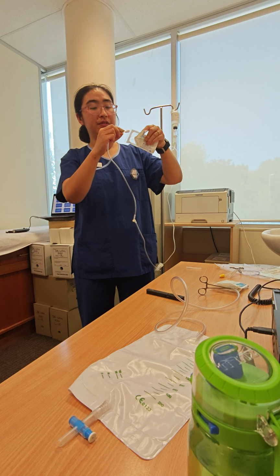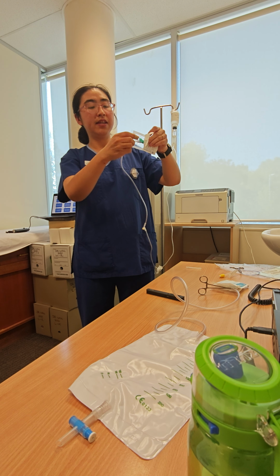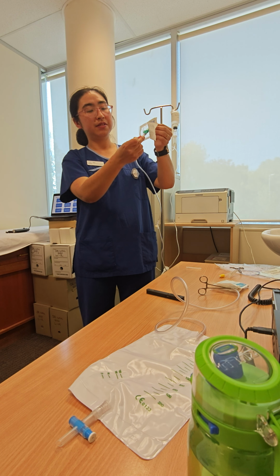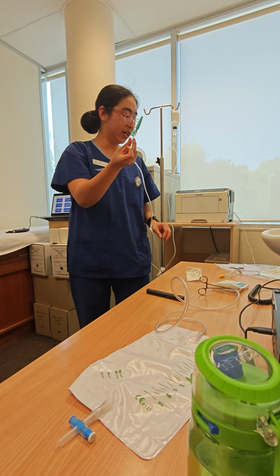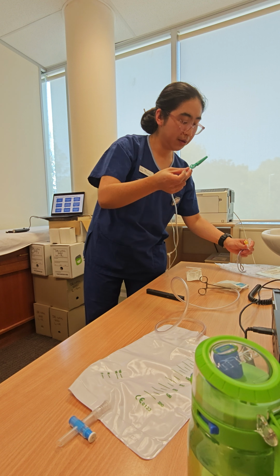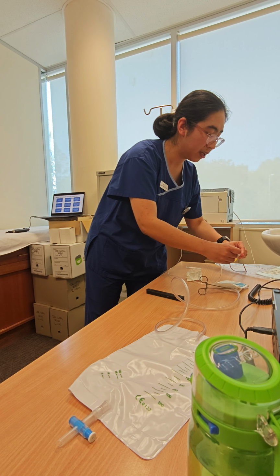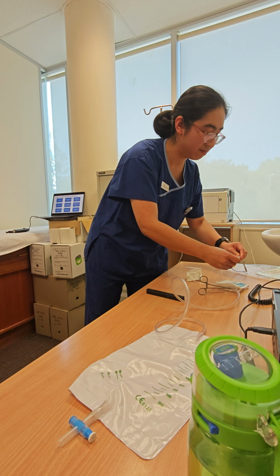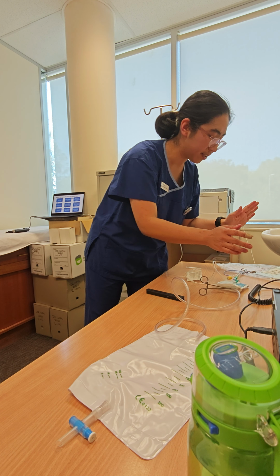Just be careful. You just touch that slightly. Also be careful, this part is sterile in part. So we just move a bit. Look at that. It's all sterile at the tip part. So we're gonna move up and put this part into the catheter slowly, but at the same time, make sure it's connected tightly, not leaking. When you're happy, good. It's all connected.